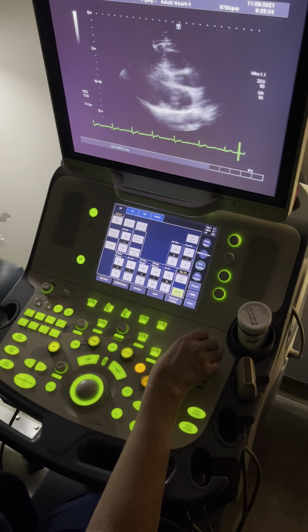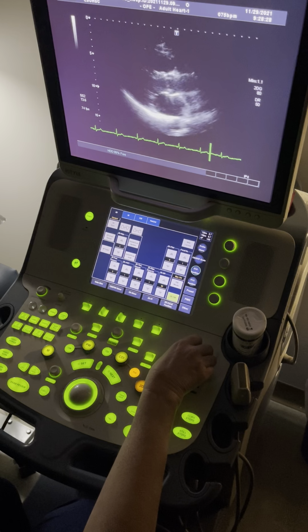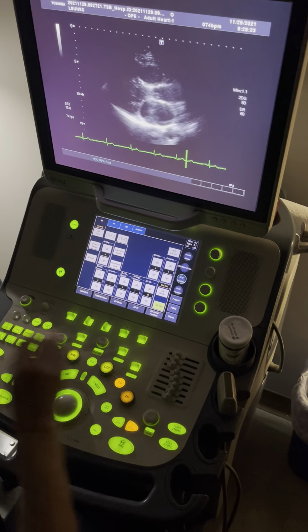Parasternal long axis. You would commit to that. It's going to take you 20 minutes. There you go. Like actually, commit. Because I'm going to keep seeing it be blurry and I'm just not going to commit. I tried to get my fiance's and I was like, I give up. Then we're going to turn the color on. You would show color over the mitral valve, and you would do color over.